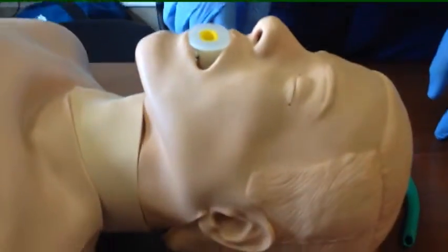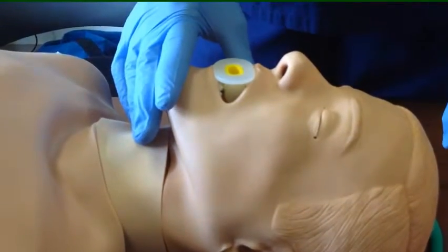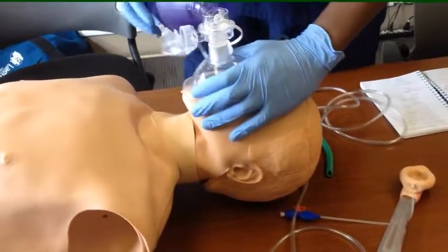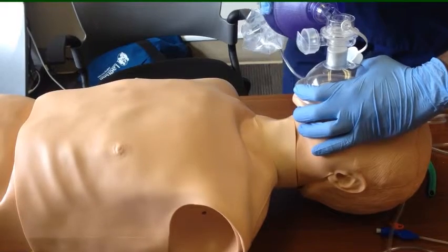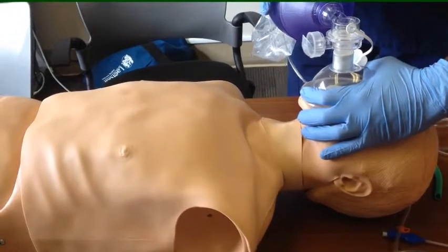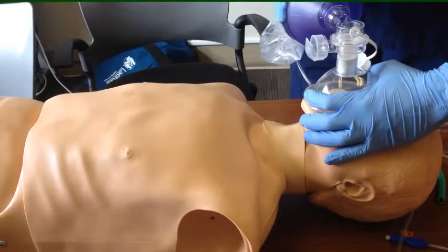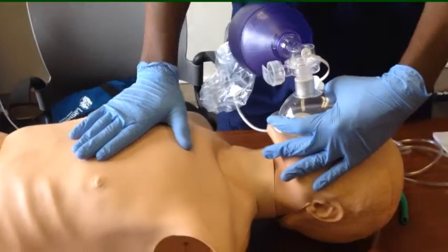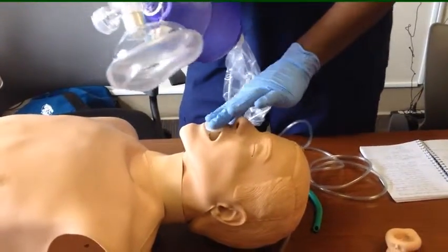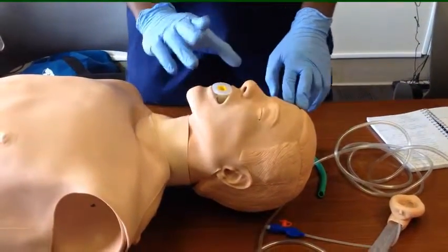And how do you know that you have really provided the right size and the right function that you wanted it to do? It's when you start ventilating the patient, one, air should be going down to the lungs. When you start bagging the patient, the only way you know that air is going down to the lungs is you are not facing any resistance. Two, you are getting a chest rise on your patient. So that means our OPA, oropharyngeal airway, is in the right place.